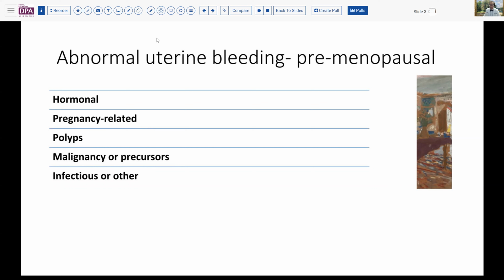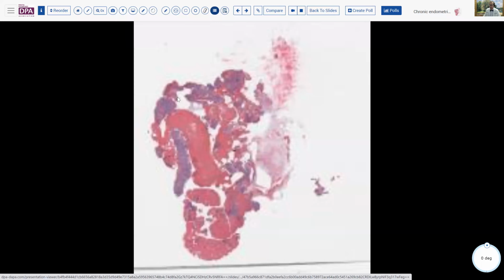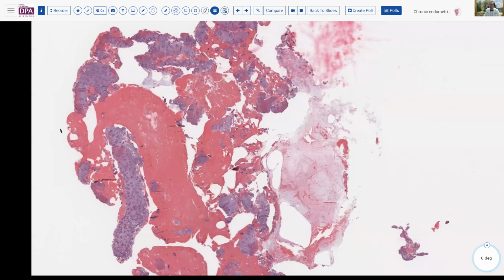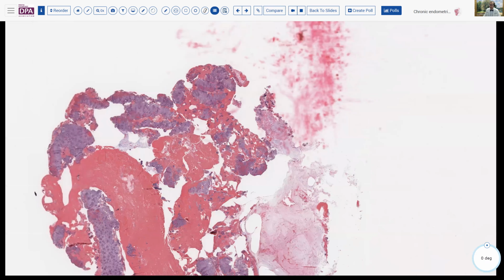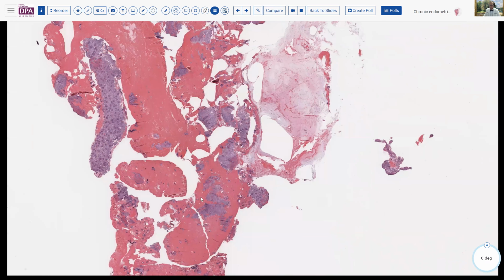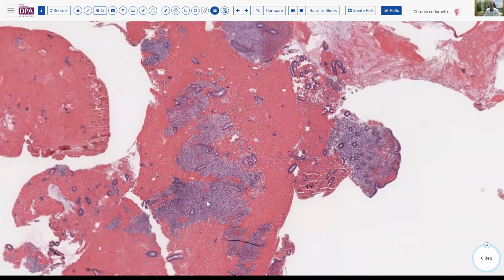So in her case, having excluded the obvious problems, biopsy ensued, and we get a nice Pipelle type of biopsy of the endometrium with a bunch of admixed blood and some mucus, as you can see here. And at low magnification, this looks morphologically fairly intact endomyometrium. We do have maybe a few more bluish areas here in one section.